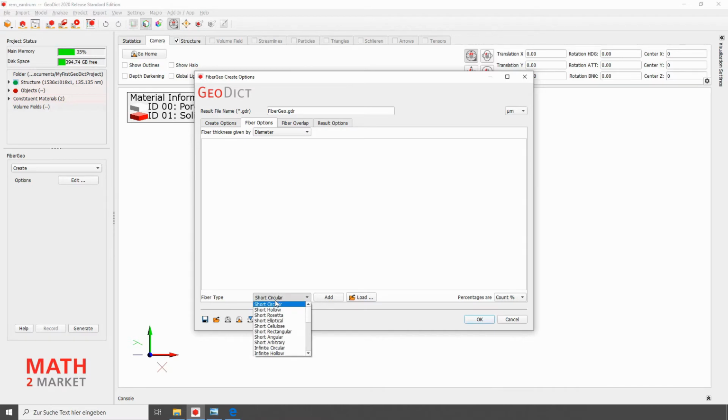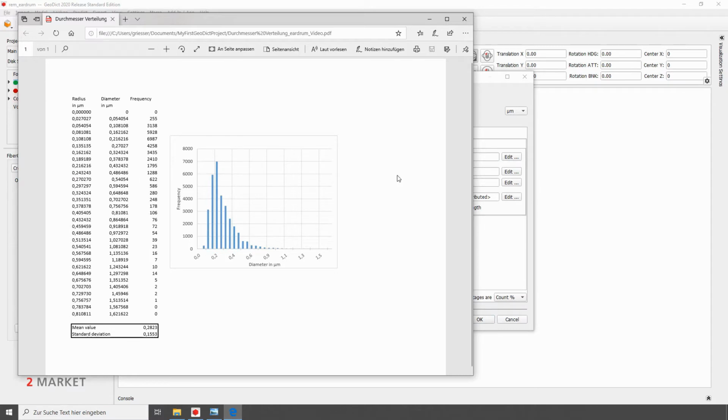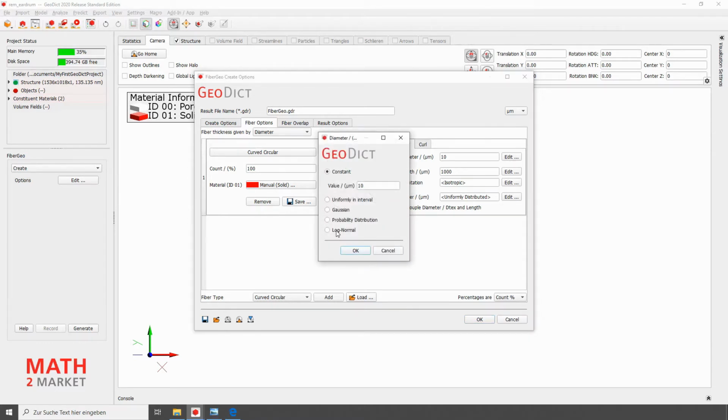Therefore, we add 2 types of fibers under fiber type. First, we start with a curved circular fiber, which we can create by clicking Add. Now we can define various parameters for this fiber type, including the diameter distribution. Of course, we want to choose the diameter distribution according to the measured distribution. Remember, this was the distribution that was measured. So here, at the diameter parameter, we select the Edit button and choose the log normal distribution.